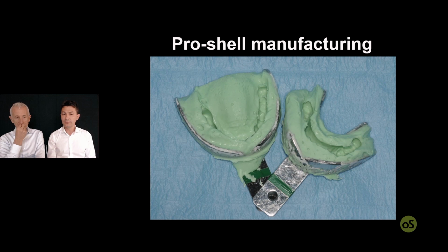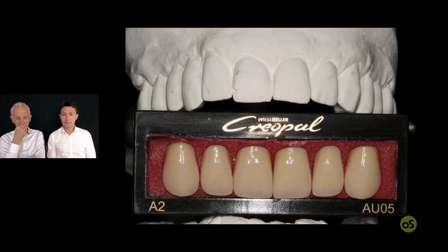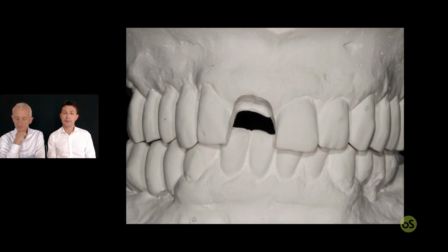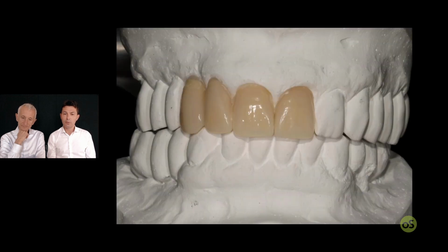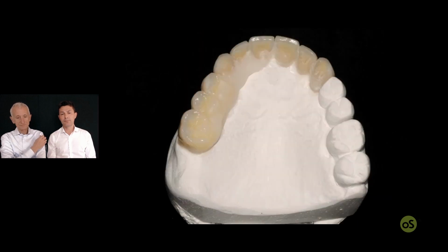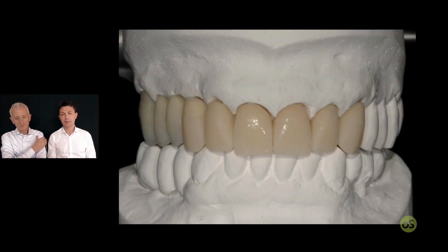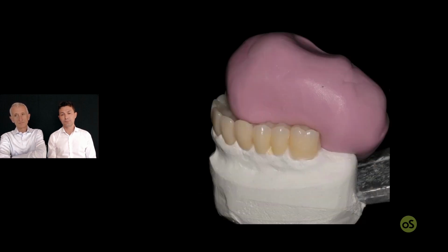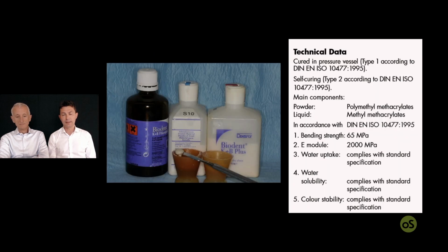If you have a big bridge, like in this case, select the teeth, more or less with the same shape, and start with the same approach. Remove and place in position the incisor, and after a bridge in the posterior. Now it's time to increase the lingual surface and get the mask. Now remove the wax, sandblast it, place again in position, and press the acrylic.